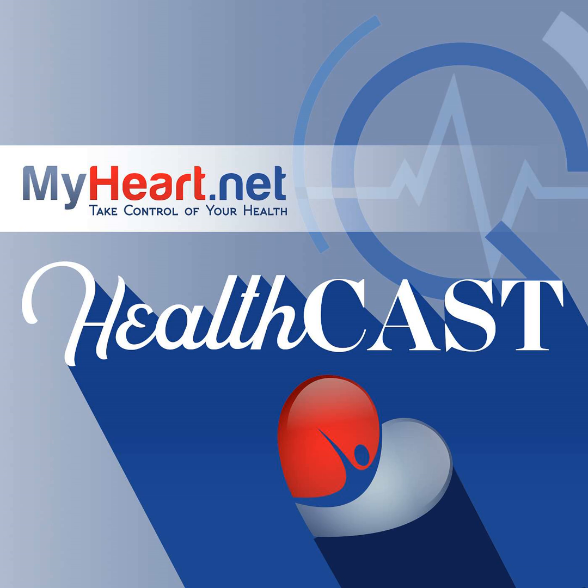At least you can have that, and then you can follow these patients, and down the road you can do some imaging. Having said that, the situation becomes somewhat uncomfortable, especially in the ED setting. If the patient is having chest pain and you just do a calcium score and tell them you don't have a calcium score, you go ahead, go home.